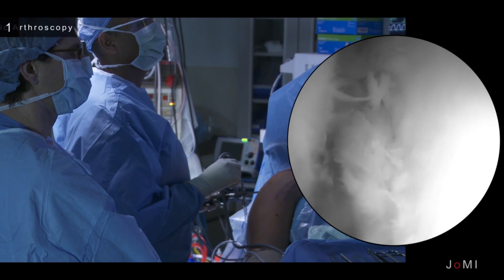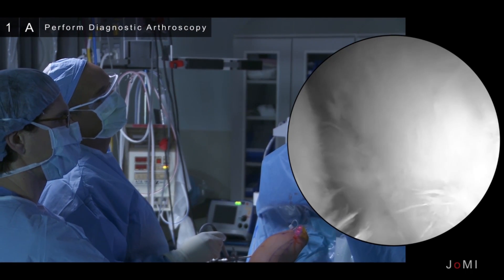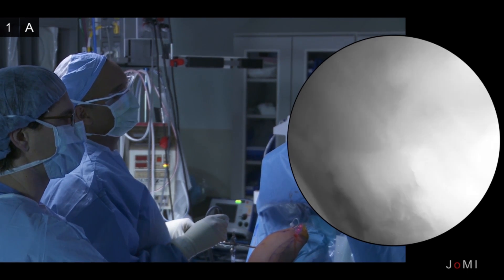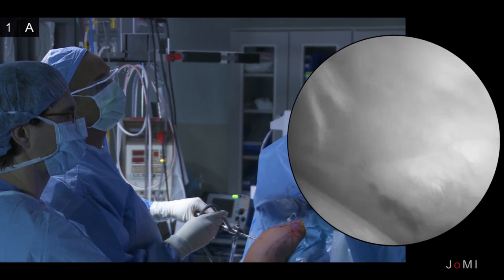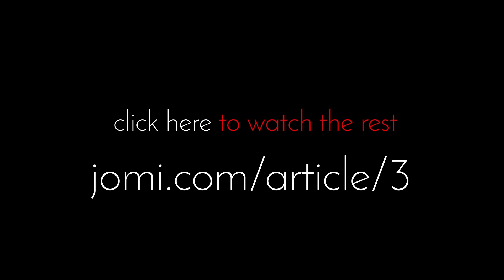Here we have the glenohumeral joint. You can see here that there are some grade one, two, and three changes. Then you get down to here and you see there's a grade four change. Likewise, on the humerus, it's completely denuded of cartilage — it's a grade four.